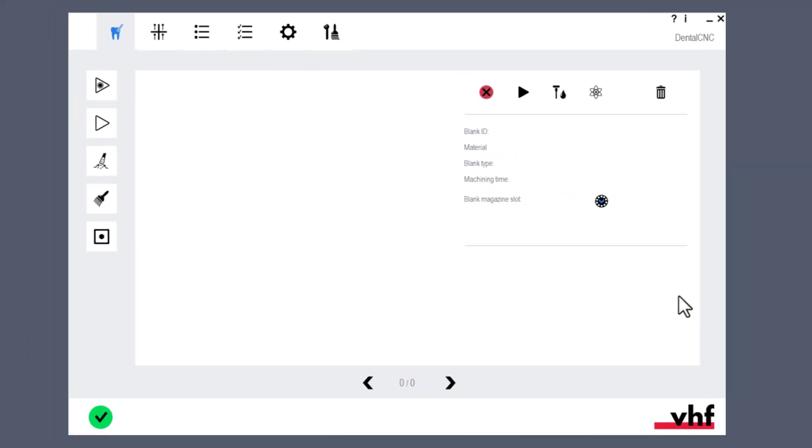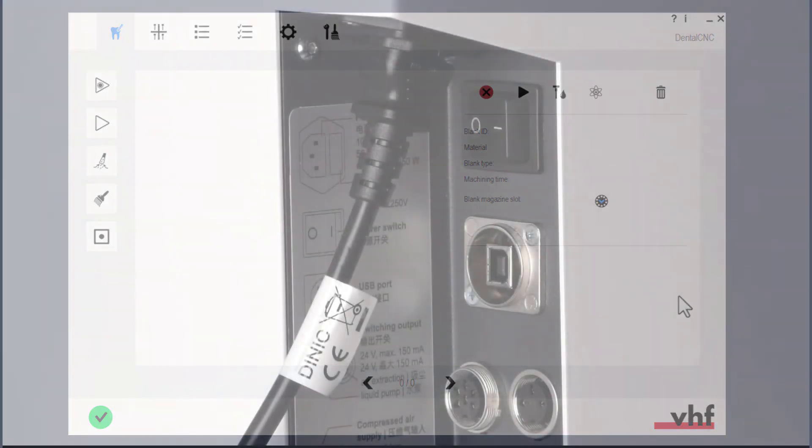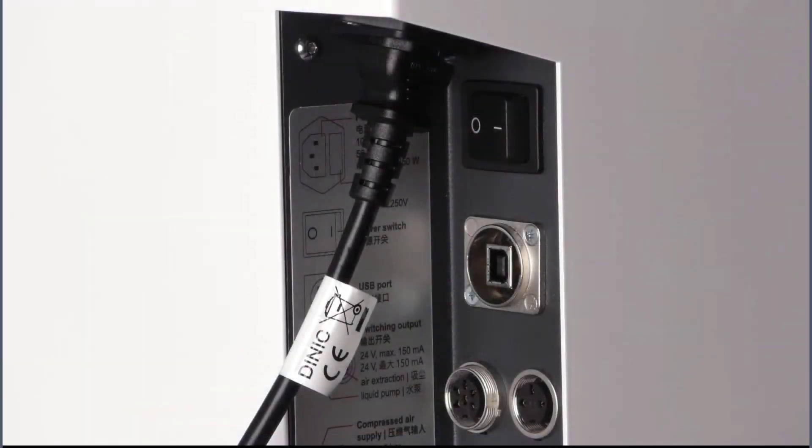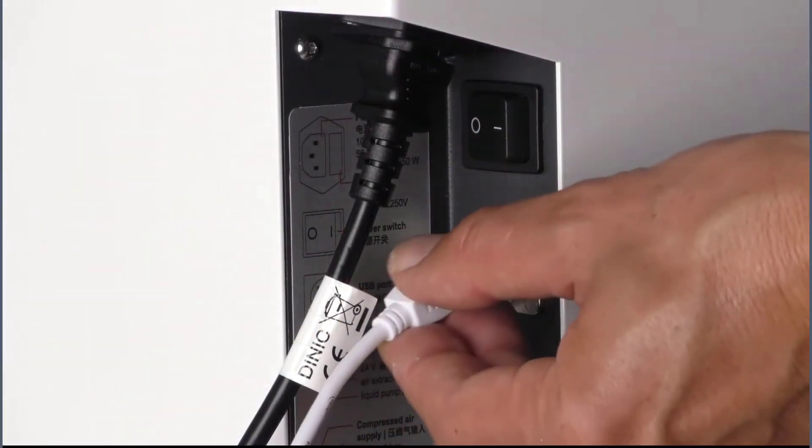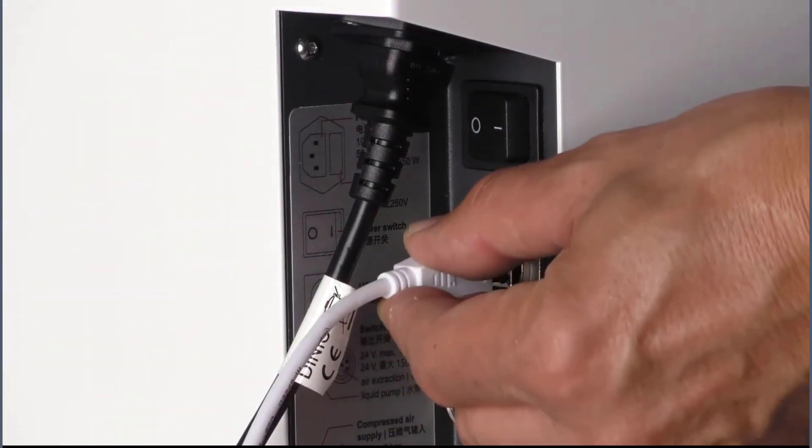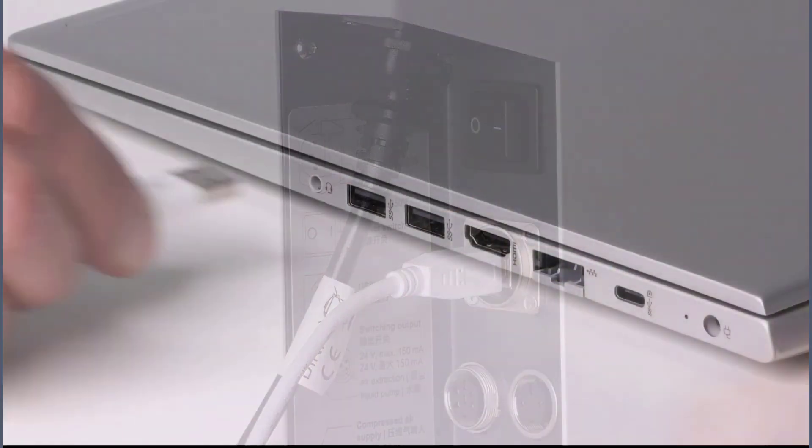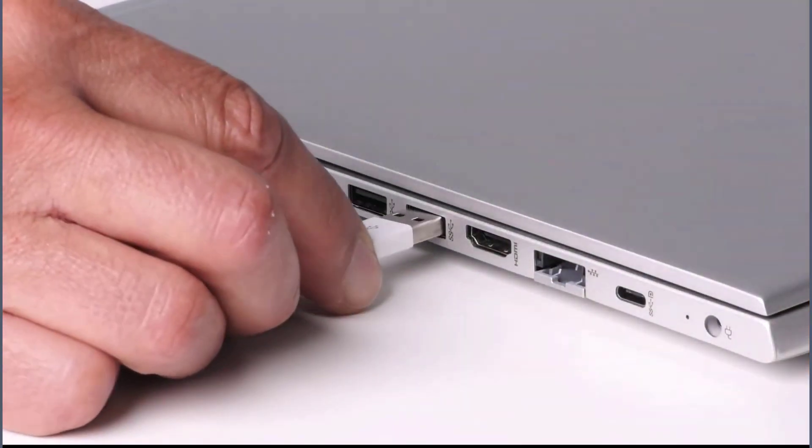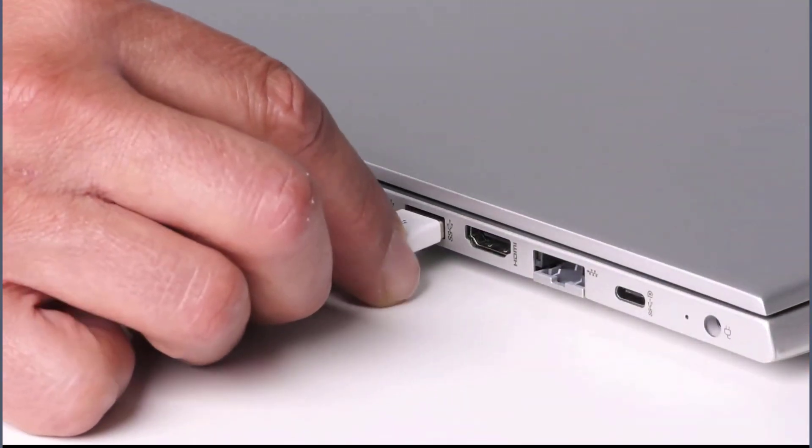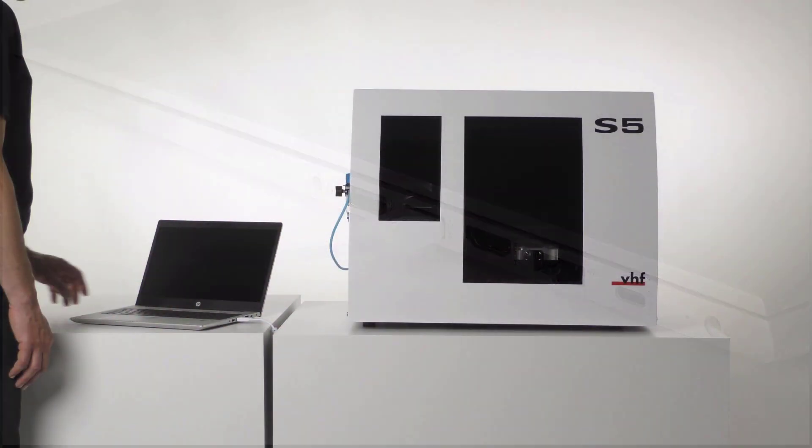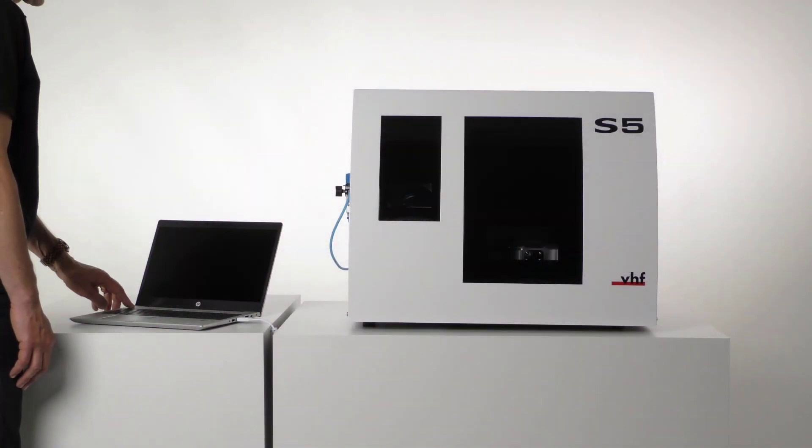In this video, we will show you how to establish a USB connection with Dental CNC. Make sure that the machine and the CAM computer are connected with a USB cable and that both devices are switched on.